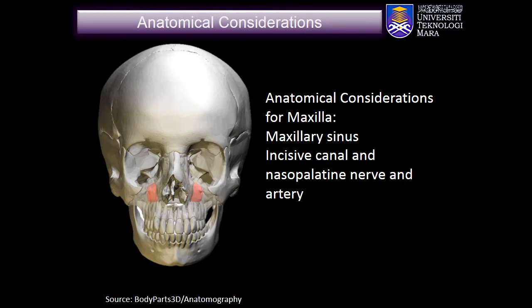Infringement of the nasopalatine vessels during implant placement to replace the centrals may result in bleeding intraoperatively. However, this is not life-threatening and can be controlled. In fact, the canal space can be grafted to facilitate ideal implant placement.